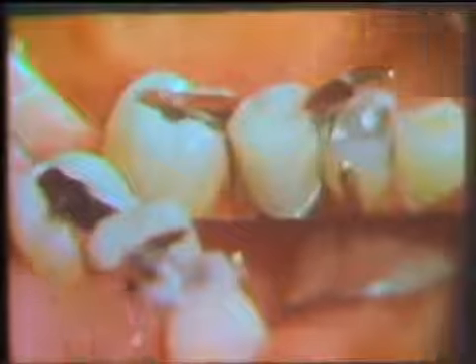The rotational path of insertion differs substantially from the conventional approach in that one segment of the partial denture is seated first, then the remainder of the prosthesis is rotated into position. Its great advantages are the elimination of clasps to improve aesthetics and reduction of tooth coverage to minimize plaque accumulation.